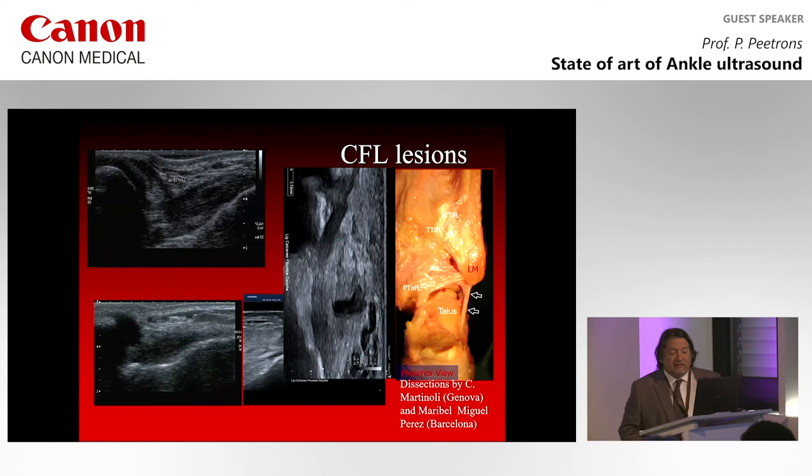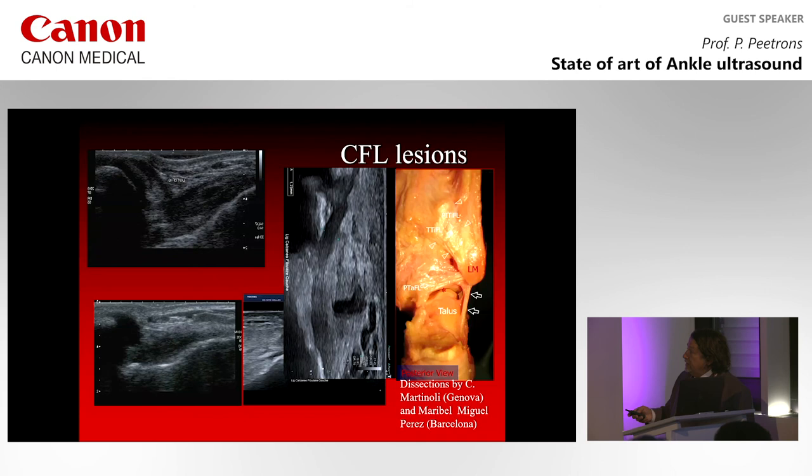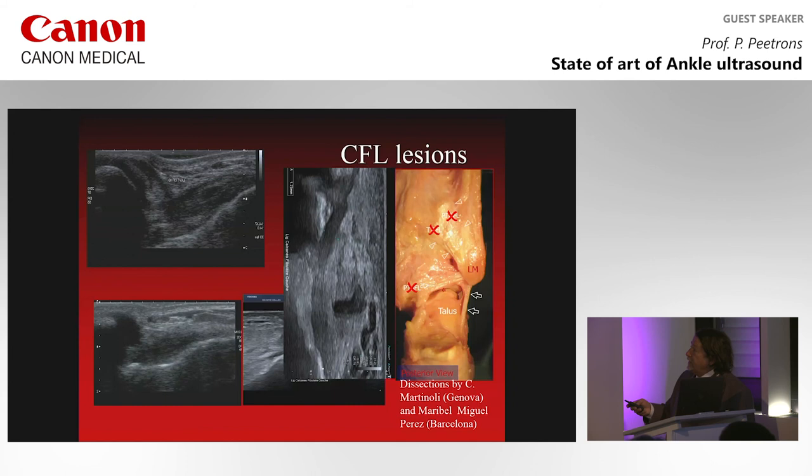So the CFL lesions, calcaneofibular lesions, you can see here that the calcaneofibular ligament is coming from the calcaneus, going over the talus and reaching the lateral malleolus. And this is now, with the new equipment, very well seen.